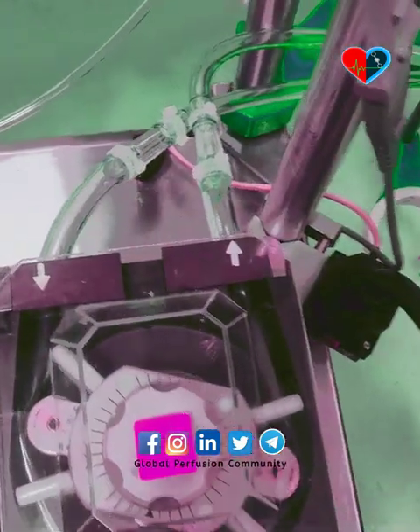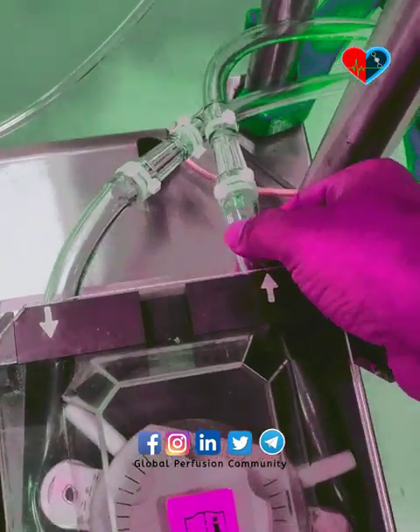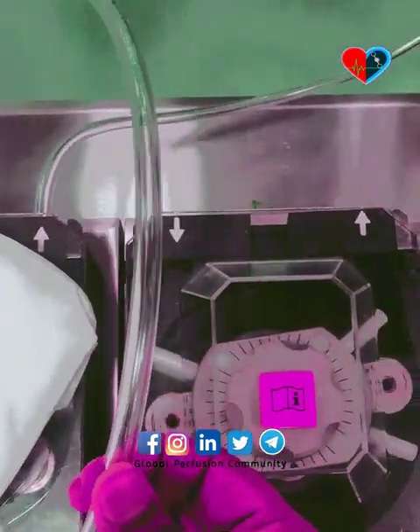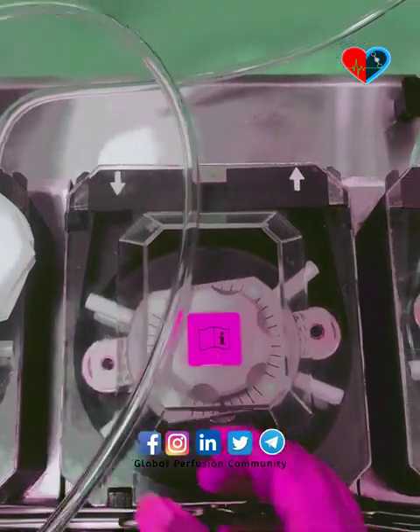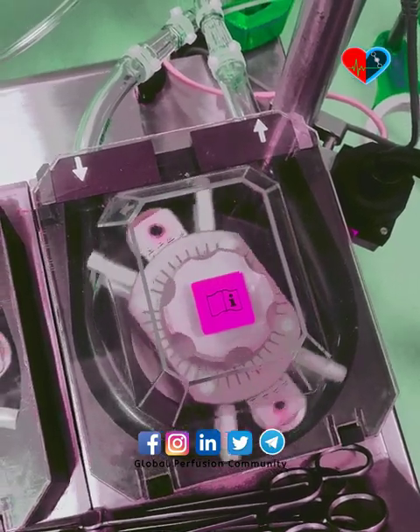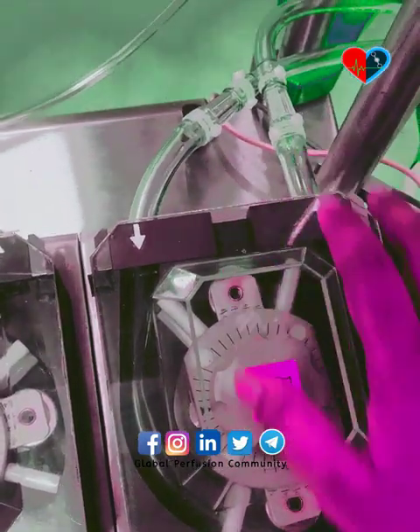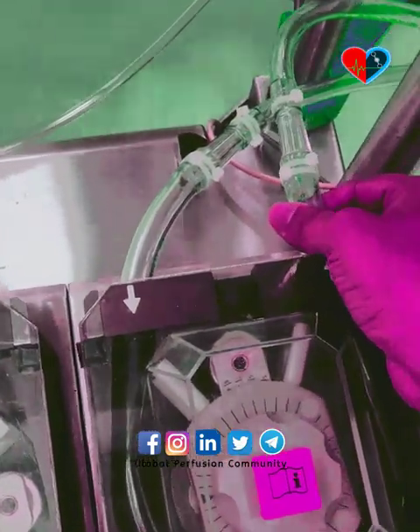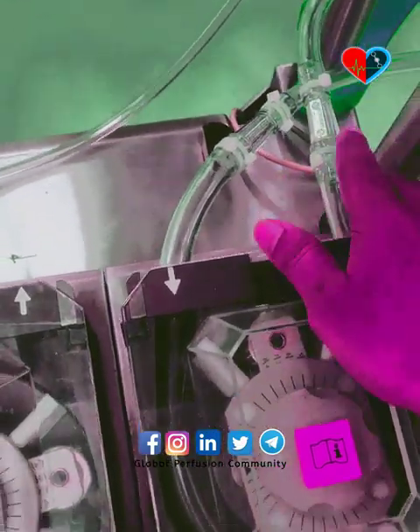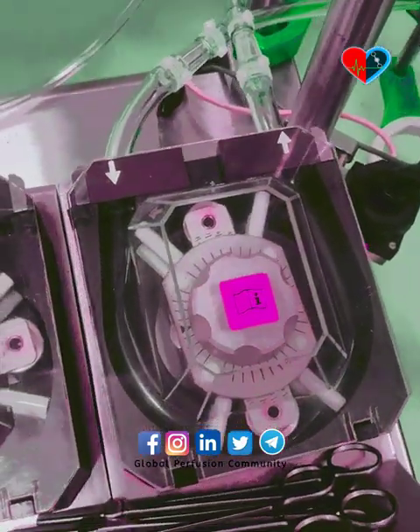As you can see, these tubings are used to perfuse the blood. There are different types of tubings and different sizes. This pump rotates in this way. For example, this is a half-inch tube and this is a three-eighth tube. This is called a pump loop.